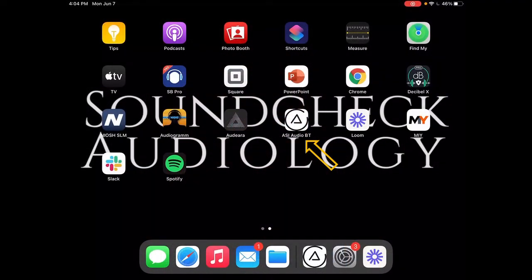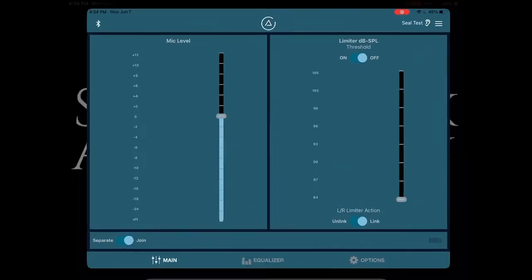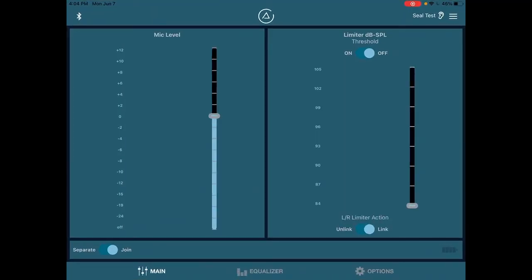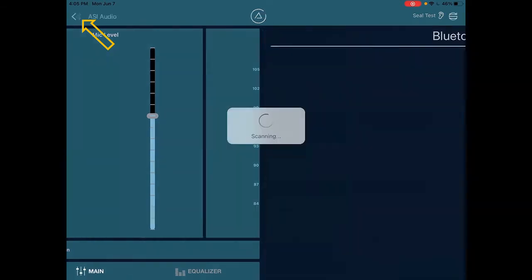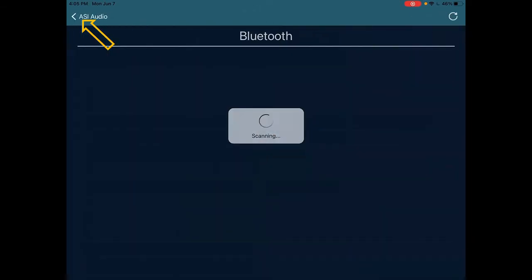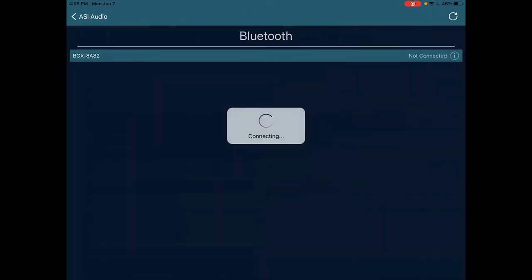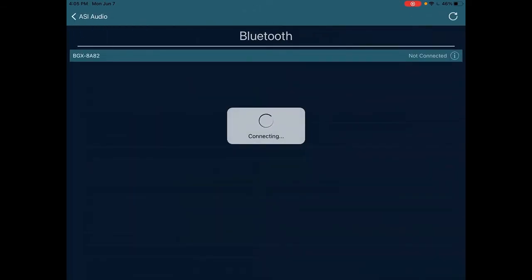Let's open the ASI audio app. Right now I have my belt pack off. I'm going to press on the Bluetooth symbol at the upper left hand side and turn my belt pack on so that it can be found. So right now it's connecting and it says connected. I have connected previously to my app so I did not get a pairing request this time. If you're doing this for the first time, you'll get a pop up that says, do you want to pair the device? And you would select pair so that it can be connected.